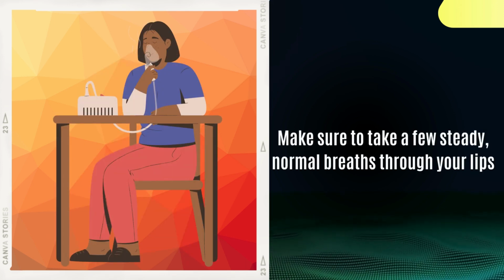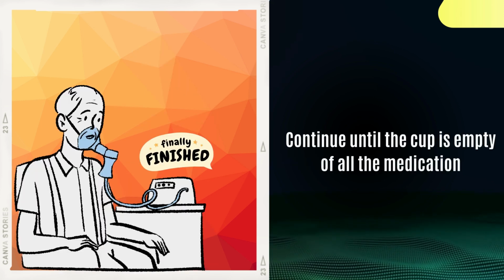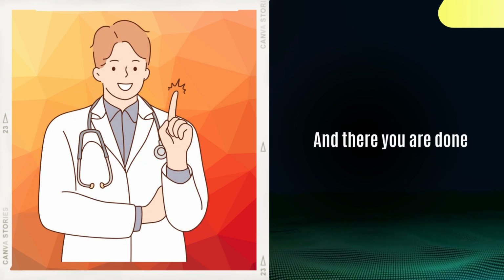Make sure to take a few steady, normal breaths through your lips. Continue until the cup is empty of all the medication. And there you are, done.